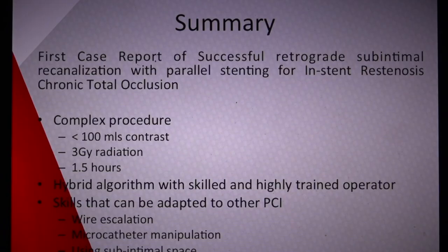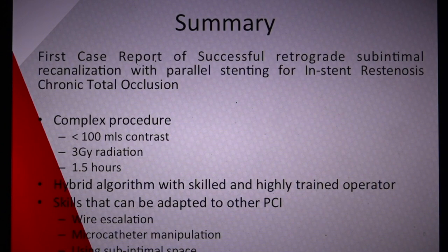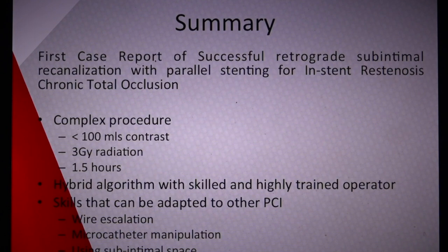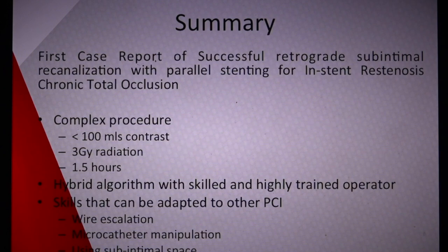In summary, at the time this was one of the first cases of successful retrograde subintimal recanalization with parallel stenting for in-stent restenosis and chronic total occlusion of an in-stent restenosis. It's a very complex procedure, but using the hybrid algorithm for CTO and pre-procedure planning, along with an expert operator, we managed to complete the entire procedure with less than 100 mils of contrast, three grays of radiation, in one and a half hours. A key takeaway is that this involves advanced CTO skills adaptable to other PCI, including wire escalation, microcatheter manipulation, and being comfortable in the subintimal space.